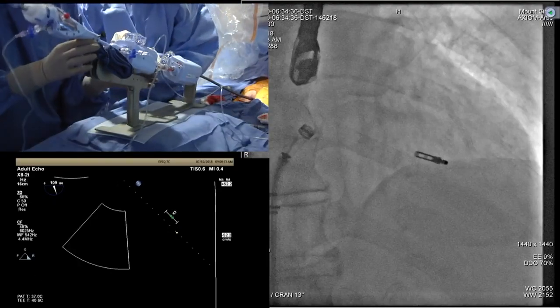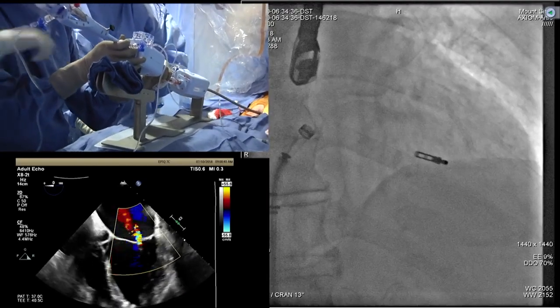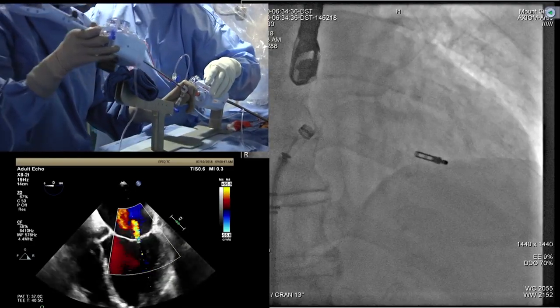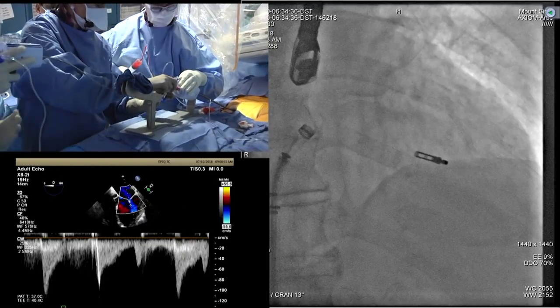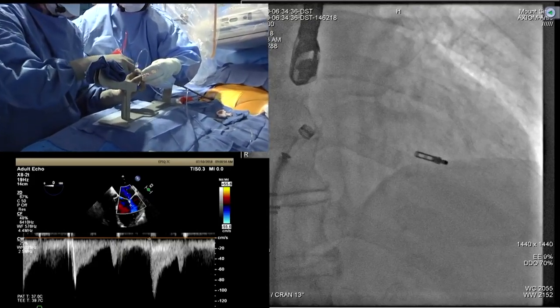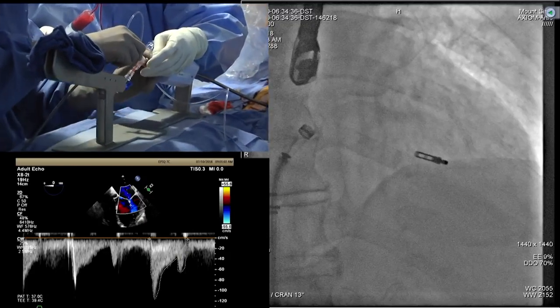So now from here it's very easy. You hold it up and from the left hand I'm pulling it out. This one. Hand here. Hand on the next one. Yeah, that's the one. Keep taking it out till it comes. See the next one. You have to see where you're going to close it. This will come out with it. No, keep going. Put the whole hand here.